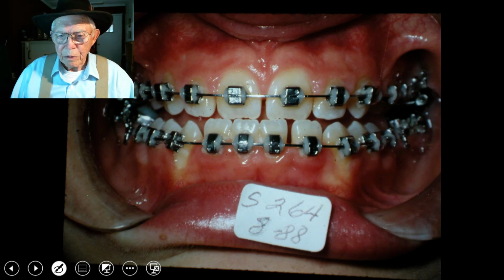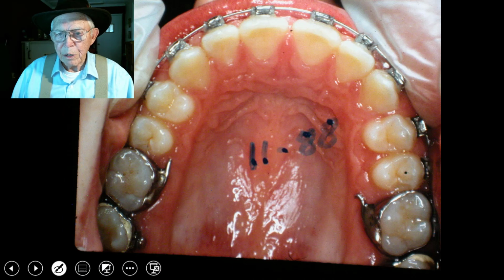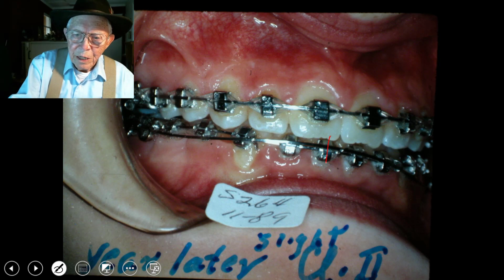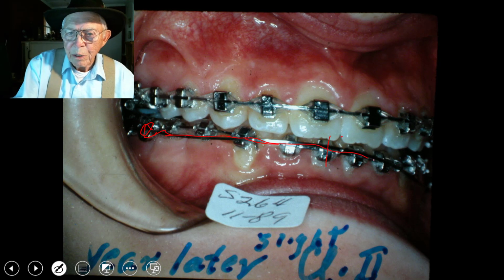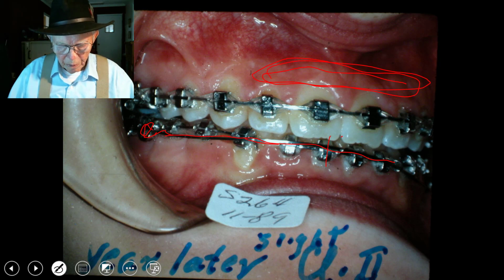Okay, here this is 1988, excuse me, and we're back pretty close, and we're still closing up space on the bottom arch. You see it closing up there, and here's the young lady. And so now we're intruding, we're bringing these teeth down so that we can get the upper to come over this. So we're intruding these teeth with this intruding arch right here. And we're bringing this forward. I really wish I had put the lip bumper up in this portion like that and help that out a great deal.